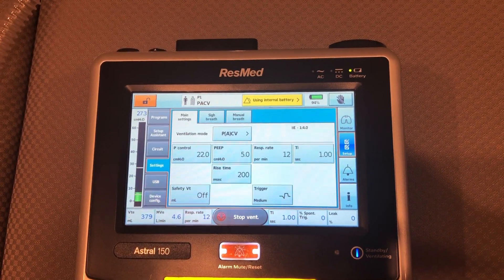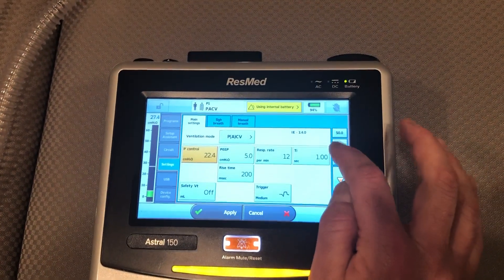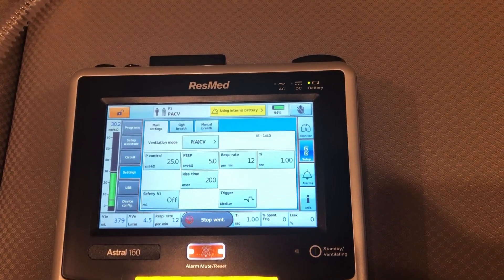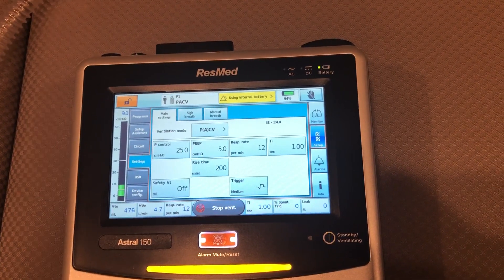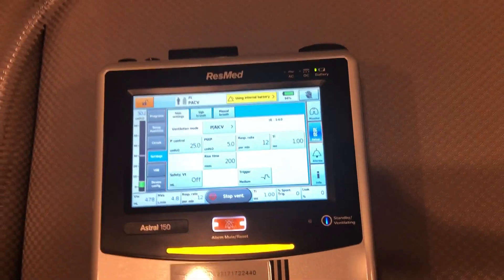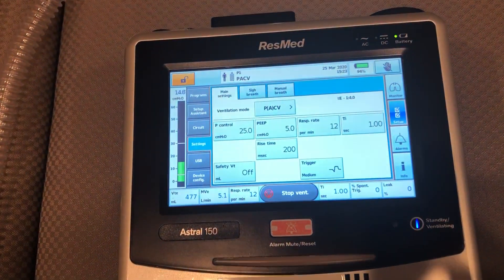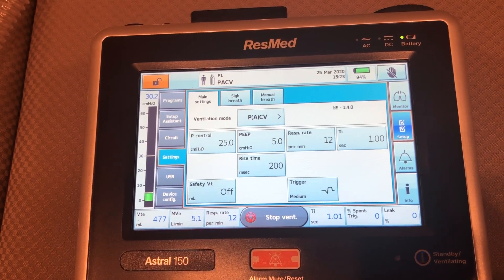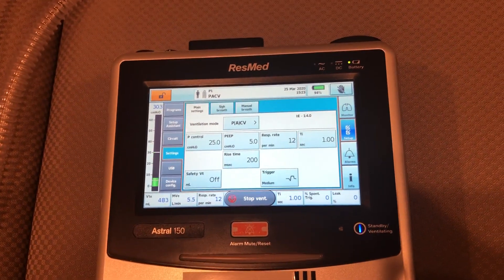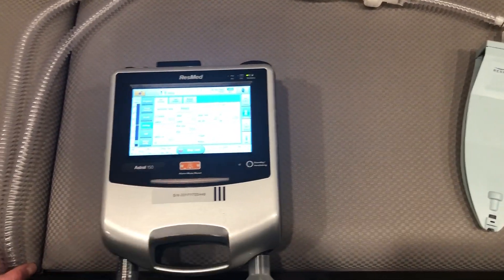In this mode, if I felt like I needed to get more volume, I can go back and increase my pressure. We're going to increase it to 25, and now we're getting tidal volumes closer to 500. I'm satisfied with what I'm getting right now.